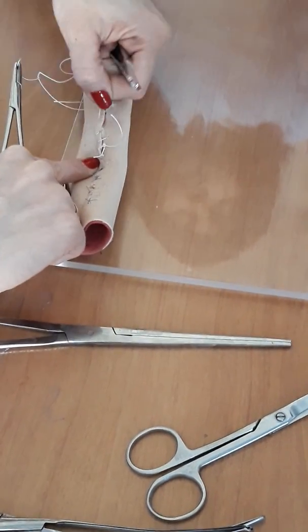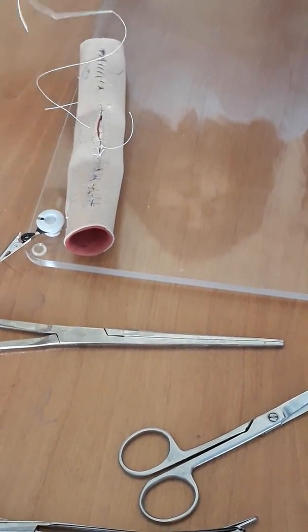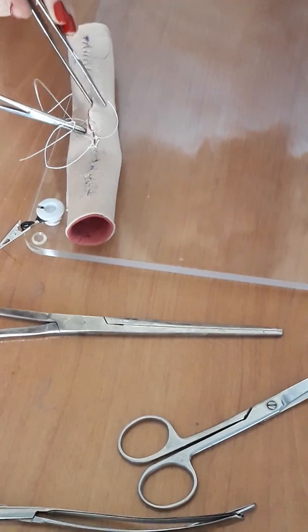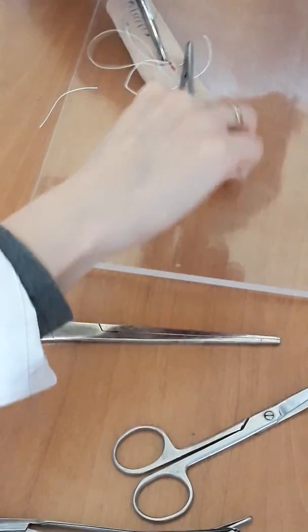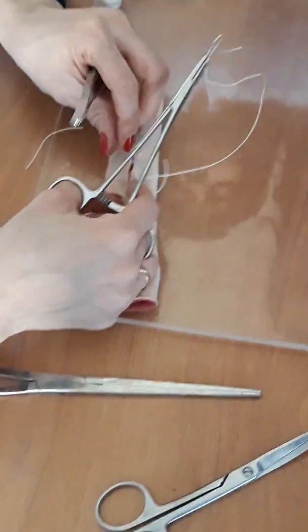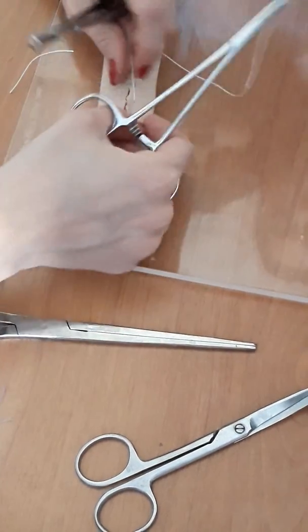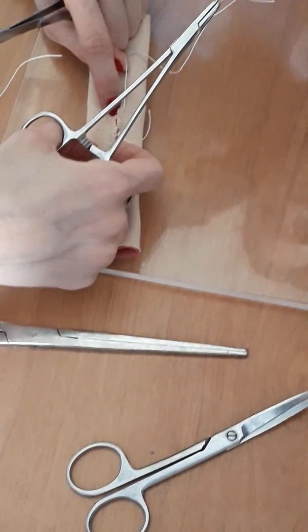And when you tie it, make one, more than one. What should you do? Also inside. If you tie it, look please, the wall of intestine invaginates inside, okay? Inside, and this is outside, this is inside.